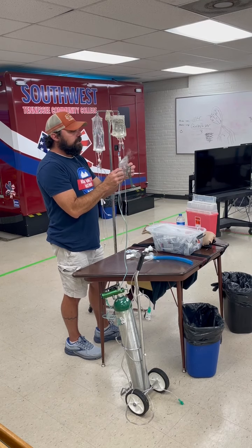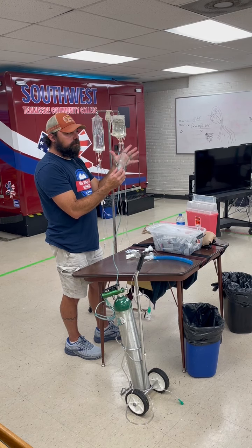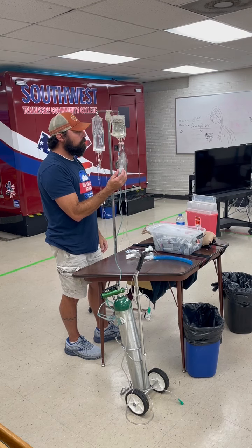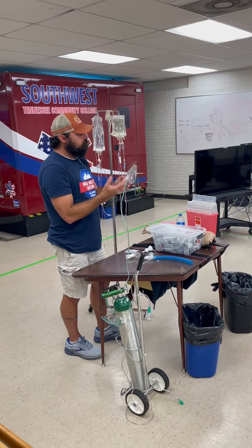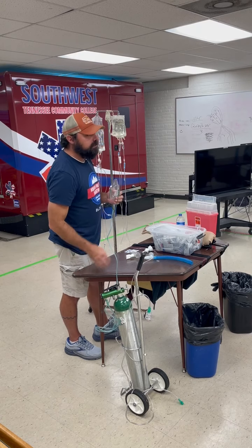Turn it on. This will be a continuous flow, but now you can just put this on their face like a non-rebreather. Boom, it's on there. They're breathing it in. Easy peasy. When it runs out, check them, reassess the patient.